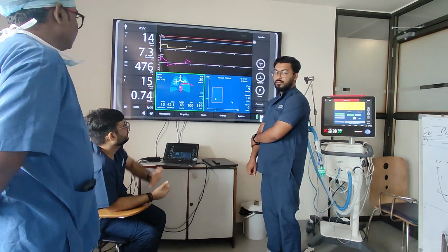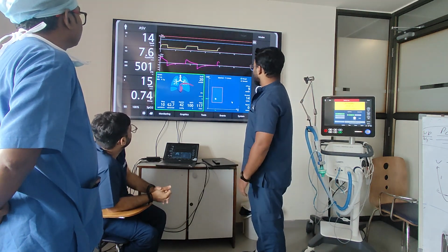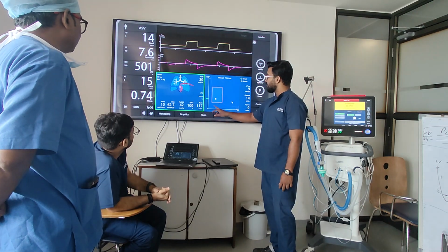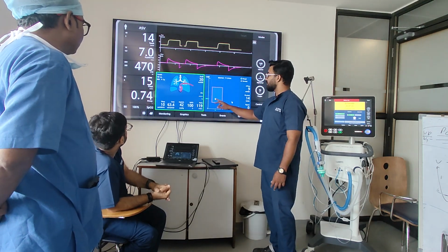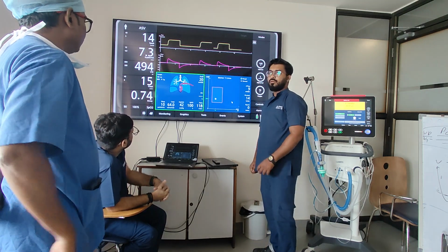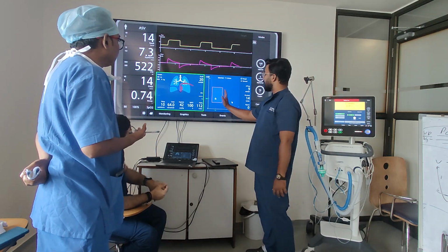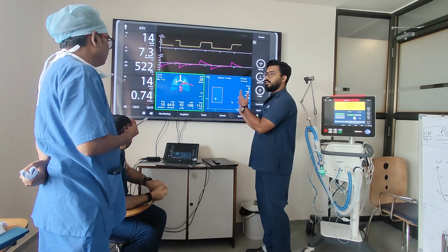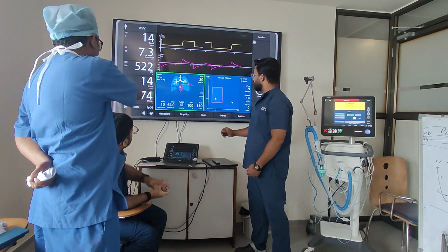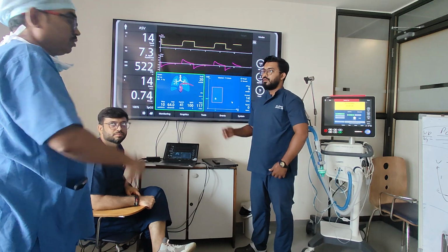So you have the graph. Now from the graph and the parameters that you can see, what can you interpret, Arshad? Restrictive, sir. RR is also low and volume is also low, sir. Ganesh, do you agree with that? Why are we saying restrictive? Because the graph is closer. So the RC expiration is 0.7, like 0.5 to 0.7.